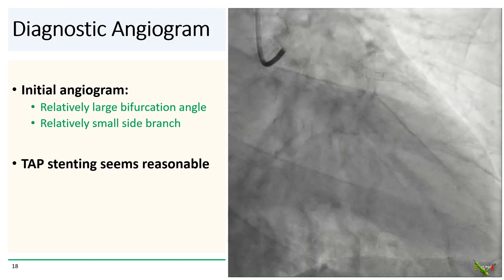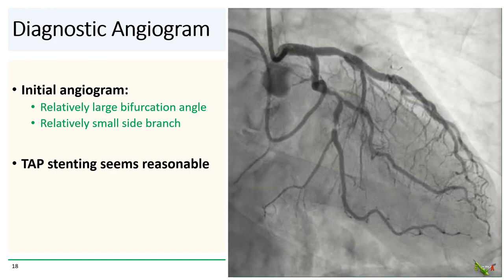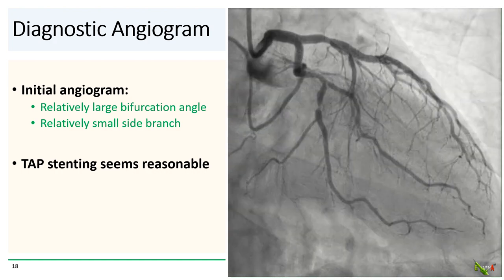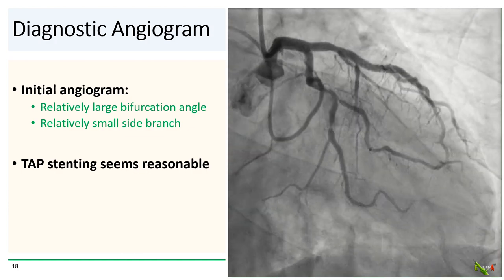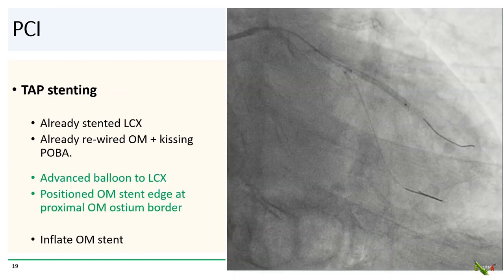So back to our patient — is he suitable for TAP? Looking at the initial angiogram, the bifurcation angle seems to be quite large and the OM is relatively small, so TAP stenting seems reasonable. Recall that we've already stented the left circ and rewired the OM and did kissing balloon angioplasty. We advanced an uninflated balloon into the circ and positioned the stent in the OM so that its proximal edge is lined up with the proximal border of the OM ostium, and we deployed the OM stent.